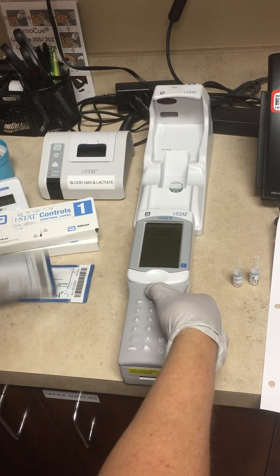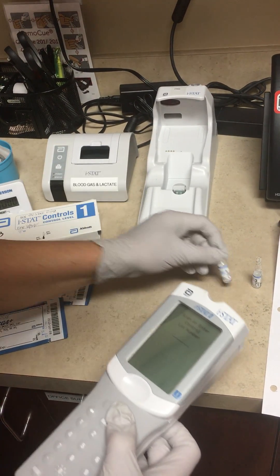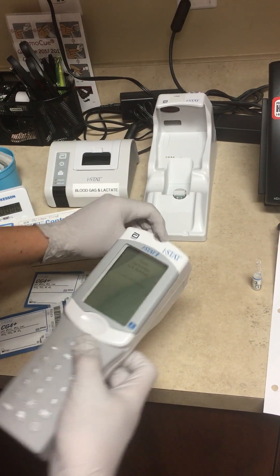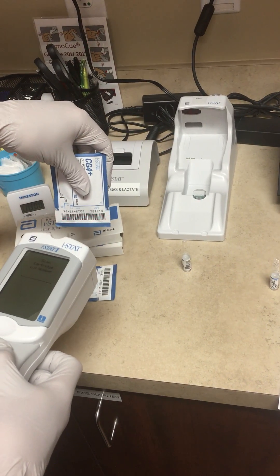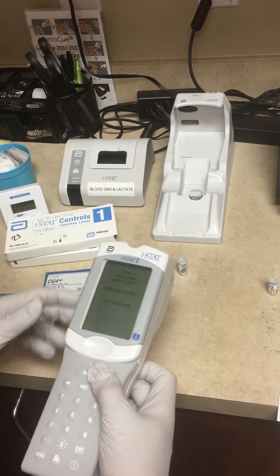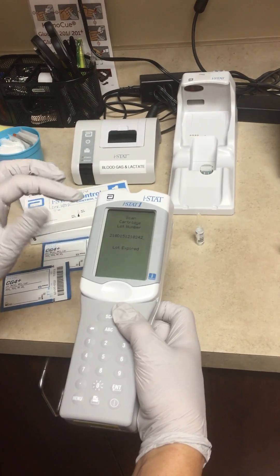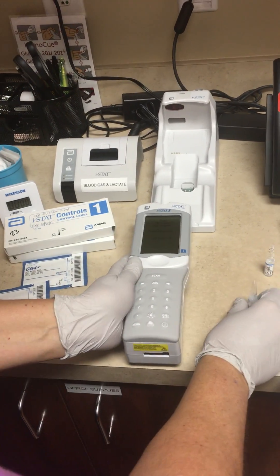We're going to scan the control lot number and then the cartridge lot number. This happens to be an expired lot number, so it's not coming up right now, but if it did, it would show you the cartridge and ready to insert it into the instrument.